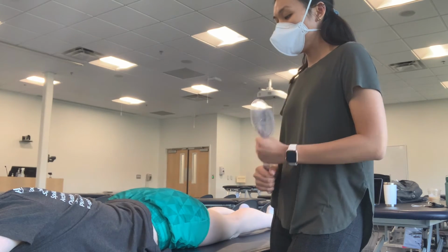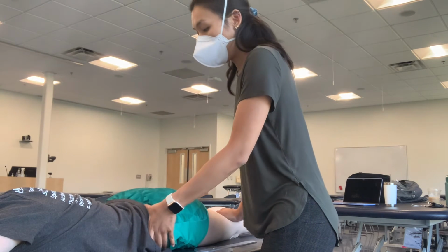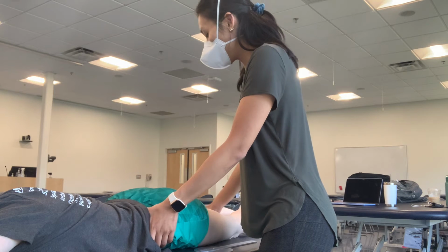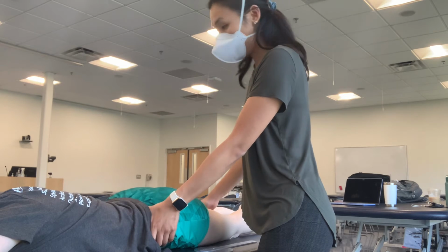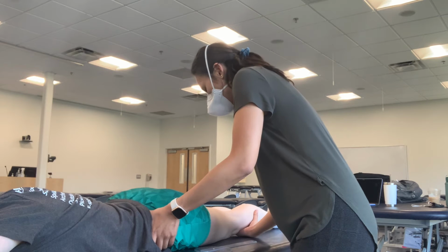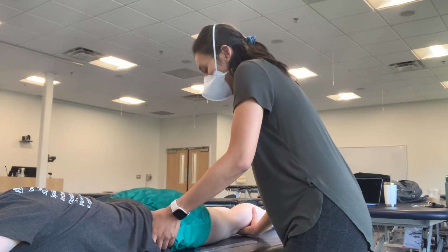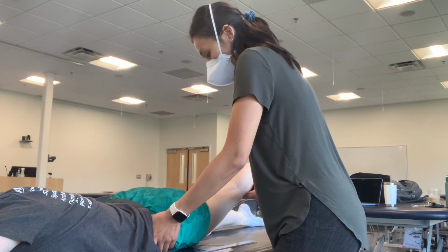So we want to stabilize the ipsilateral pelvis by placing our hand on the ASIS and the PSIS to prevent it from anteriorly tilting. And we want to also make sure that the contralateral lower limb is flat on the table. So for the testing motion, we want to stabilize the ipsilateral pelvis, and we want to keep the knees extended, and we want to lift and extend the hip.